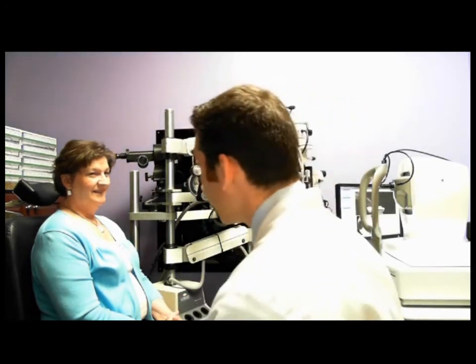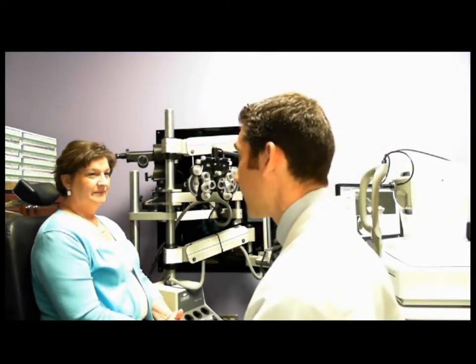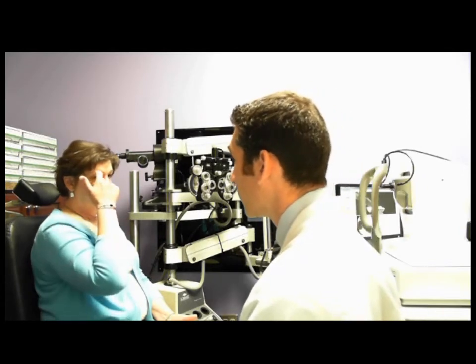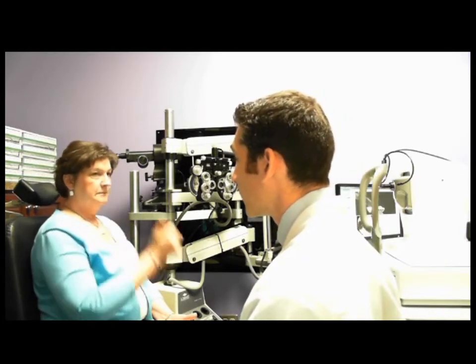And the very first thing that I'd like to know, even before I walk in the room, I have my technicians ask about the comfort of the lens. And so since we don't have our techs here today, we're going to ask ourselves. Darlene, tell me, how do these lenses feel? The left feels good. I can feel the right one. Okay, where do you feel it? Just up in this area. So off to the side.